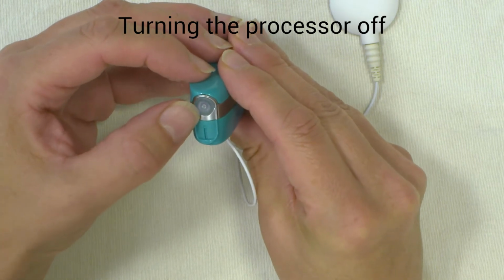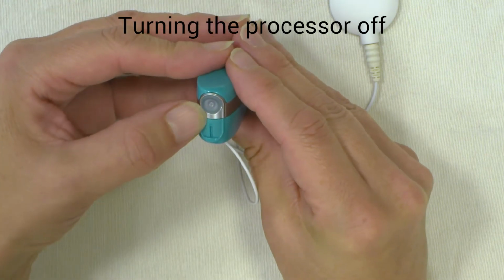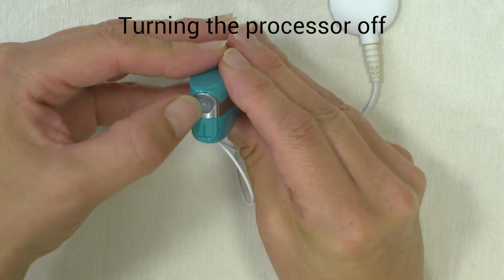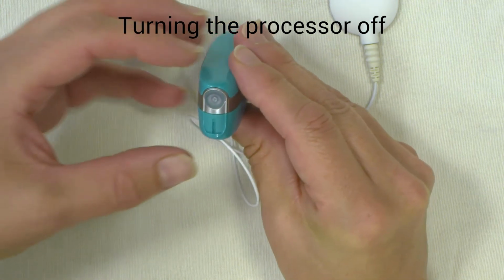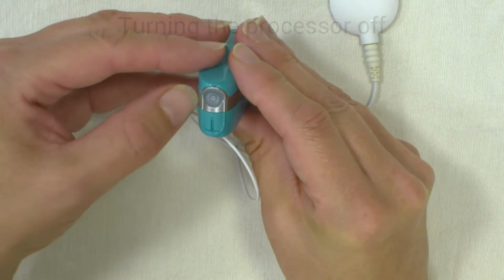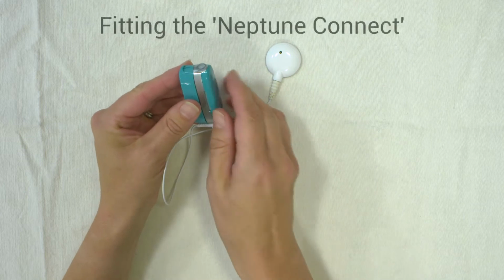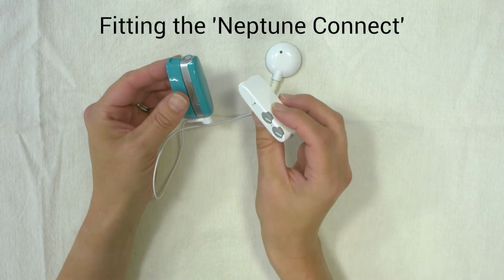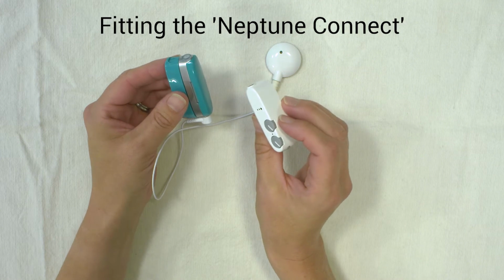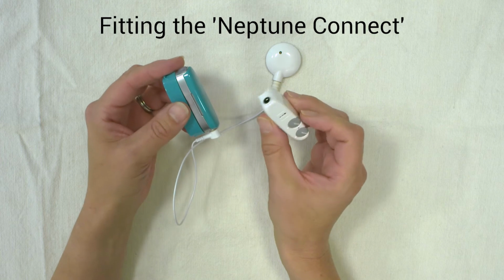If you hold that button for too long, the processor resets. So it's about 2 seconds to hold it down. If you hold it for 4 or 5 seconds, the processor resets. In order to change the program on the Neptune, you need an additional switch, which is called a connect. Again, this will be issued when you receive your processor.